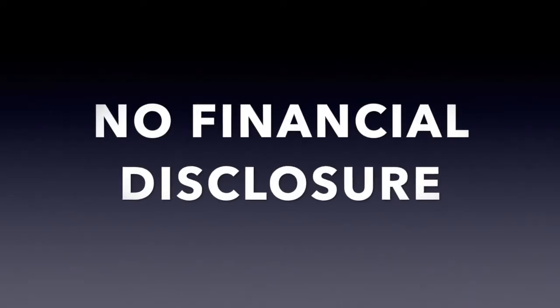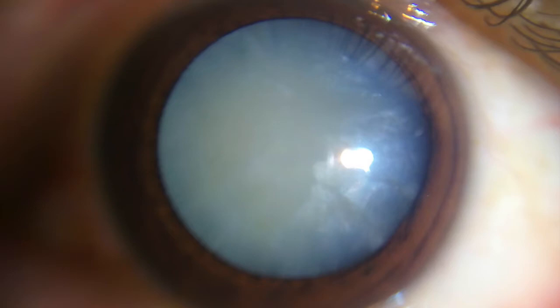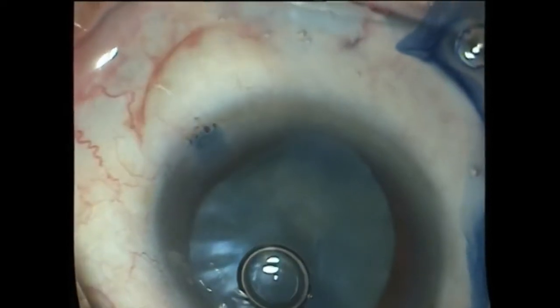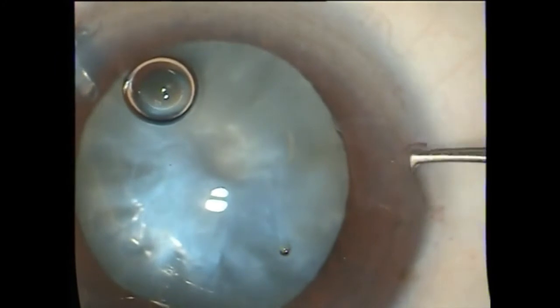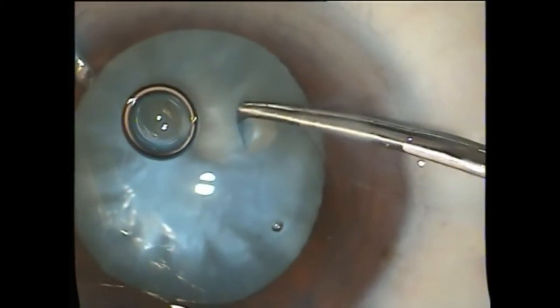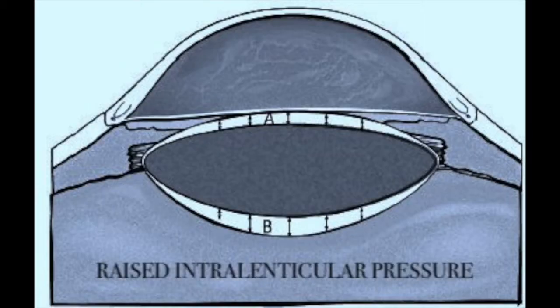Creating a continuous capsulorhexis in an intumescent cataract is always a challenge because of the raised intralenticular pressure caused by the liquefied cortex. Intumescent lens runs the risk of rapid tear to the lens equator, developing once the anterior capsule is opened despite OVD in the anterior chamber.